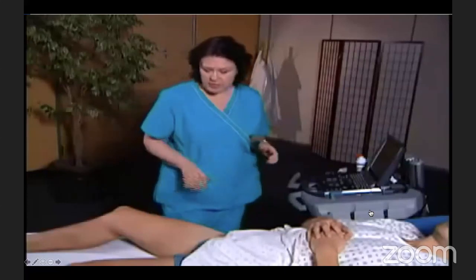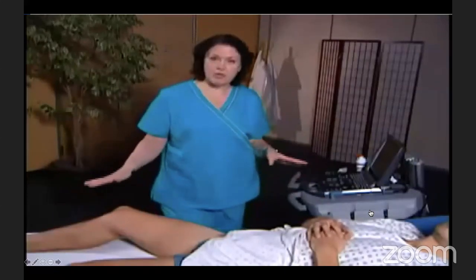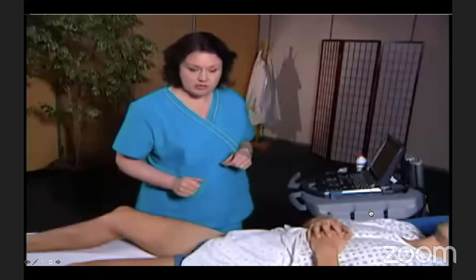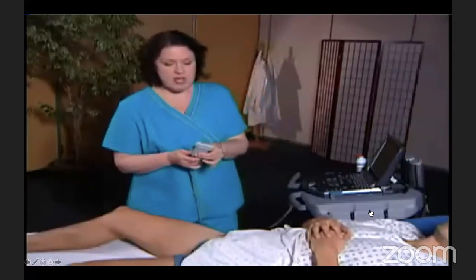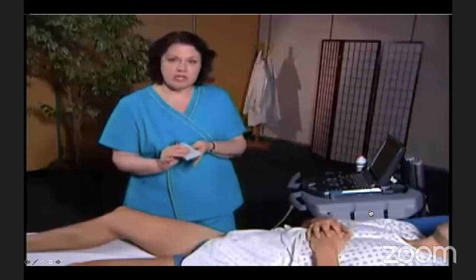To set up for this examination, you want to tilt the gurney so that you're in a reverse Trendelenburg. This encourages venous distension in the leg, so it's easier to visualize the veins with ultrasound. We're going to use a linear transducer for this examination, and the views that we do for this exam will just be in a transverse orientation only.